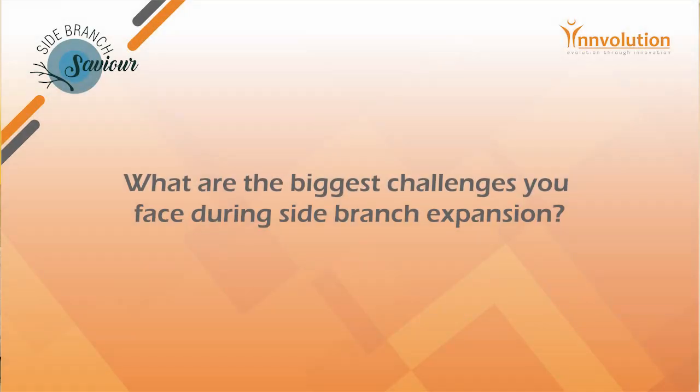Side branch protection is mainly done by keeping a wire inside the side branch. Side branch expansion all depends on the stent quality, stent profile metrics, and the bed preparations.